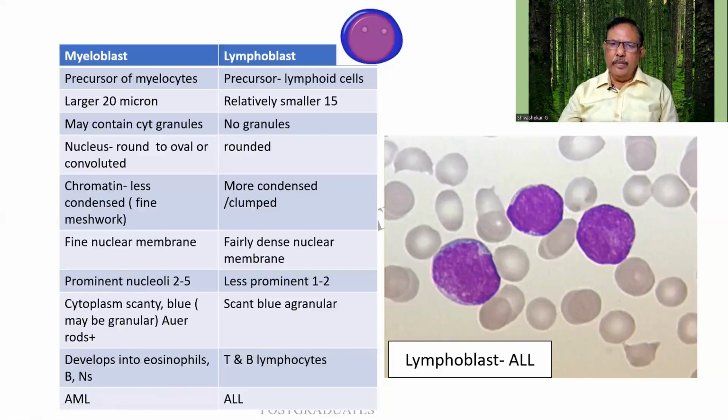Incidentally, this is the type of leukemia. The RBCs are normal, normocytic, normochromic. Some schistocytes are there, fine. Platelets are reduced. And there are abnormal cells varying in size. This is a small cell and I'm seeing two large ones. A mixture of the small and the large cell, which is typical L2. So it is a lymphoblastic leukemia that I'm seeing.